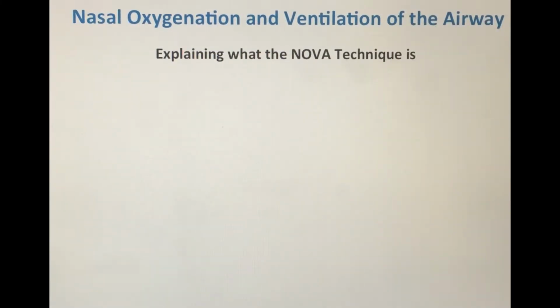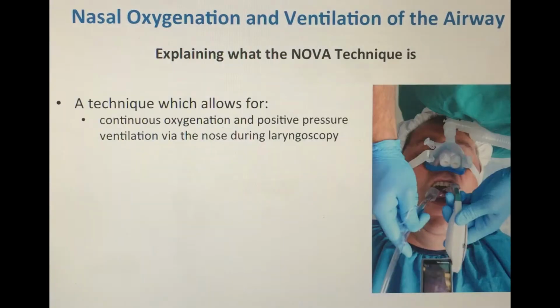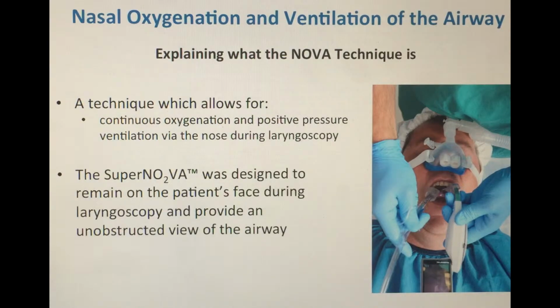You want to first start off by explaining what the NOVA technique is. NOVA stands for nasal oxygenation and ventilation of the airway. Essentially, it's a technique which allows for continuous oxygenation and positive pressure ventilation through the nose during laryngoscopy.